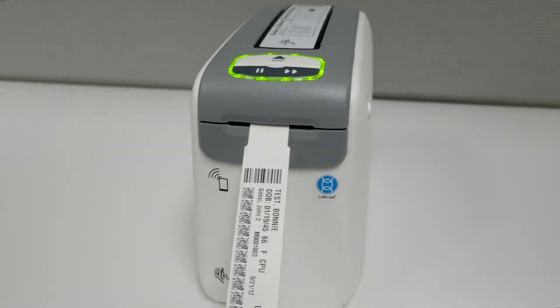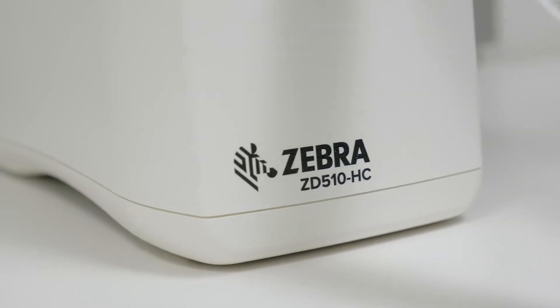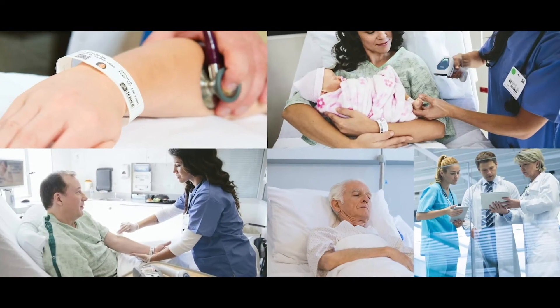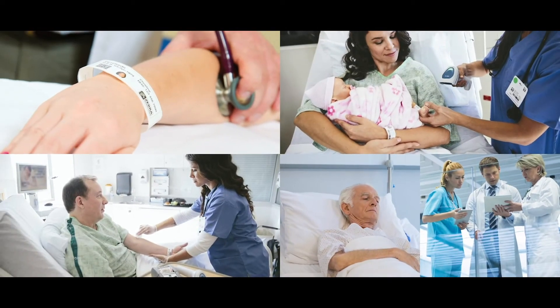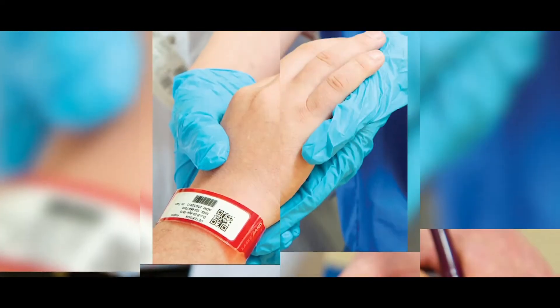As the inventors of the ZD510HC wristband printing solution, Zebra takes patient ID seriously. We understand that hospitals need a durable, comfortable, and easy-to-use solution for their patients, clinicians, and admissions.